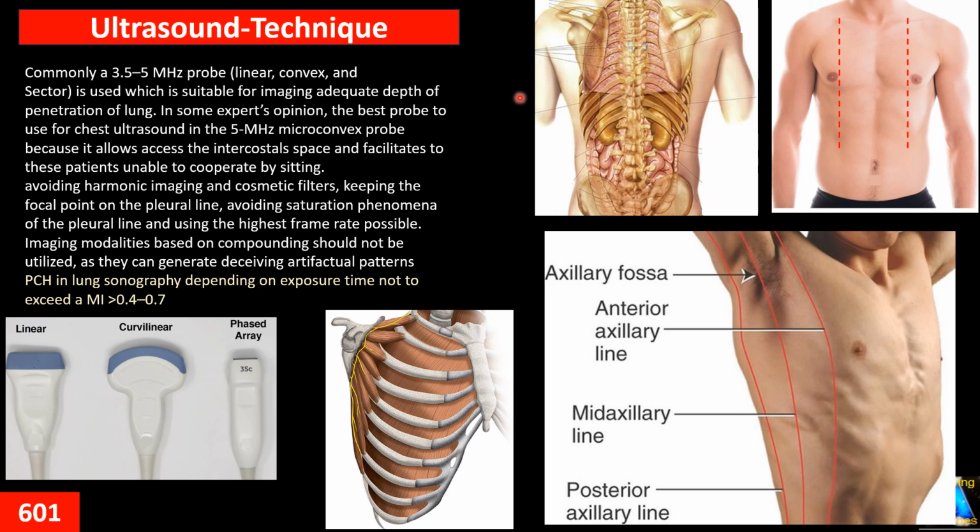And when we are scanning and documenting, we have to remember that we have to scan and survey that area, not one spot. We survey that area, left and right, medial and lateral. Then, if we find there is no pathology, for documentation, one in the mid clavicle, and we annotate exactly where we are and what the orientation of the probe is.